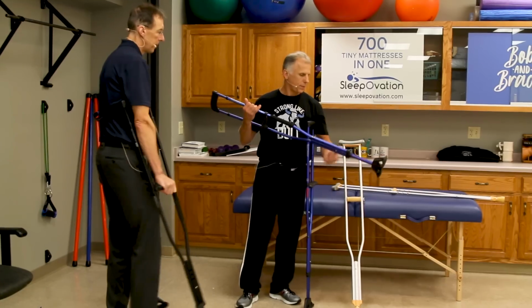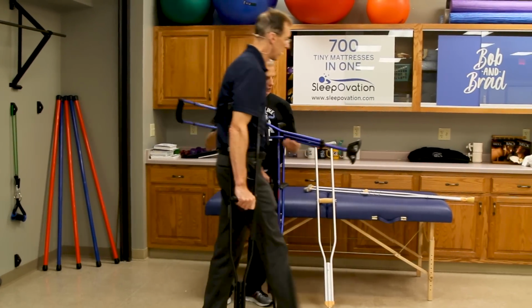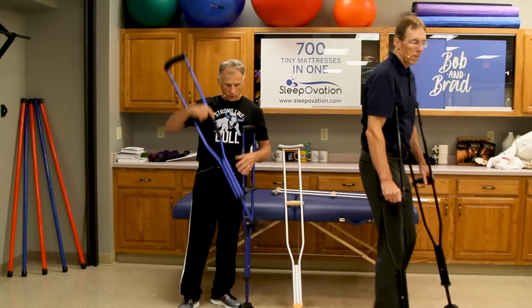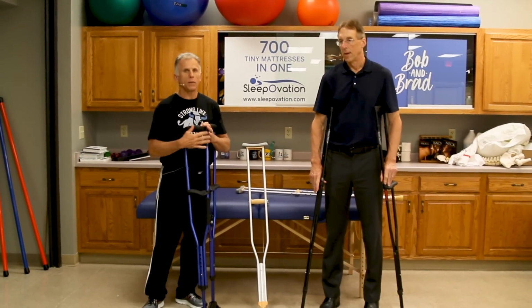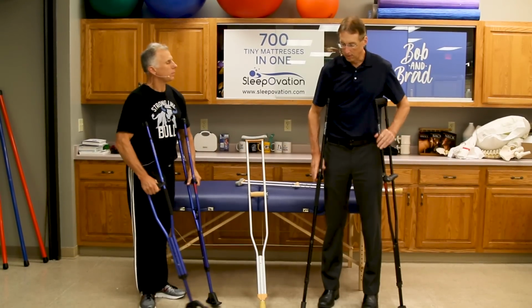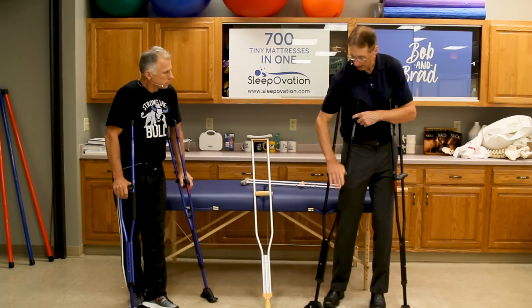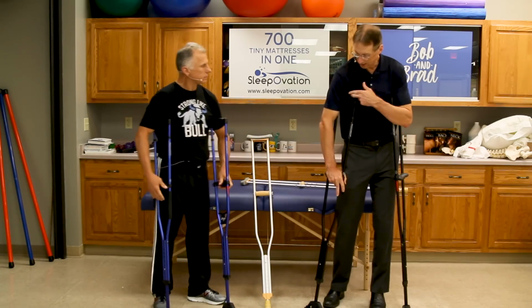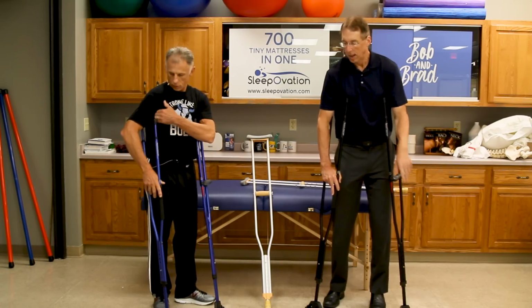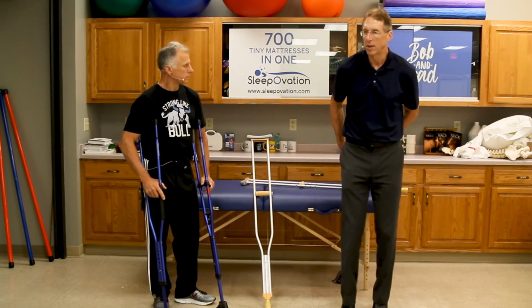And they're like typical crutches. You can adjust them. You don't need a wrench or anything, just your fingers, and it's a snap to adjust. You have to adjust the top part and the lower part, and once you get adjusted, you're done. Generally you adjust the top part so that you have just a slight bend, like 15 degrees of the elbow, and still have room underneath the arm. 2 or 3 fingers. And that's how you're going to adjust the full length too.